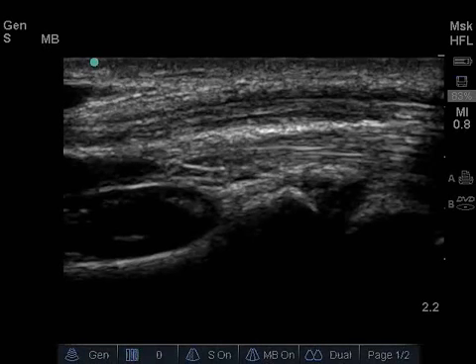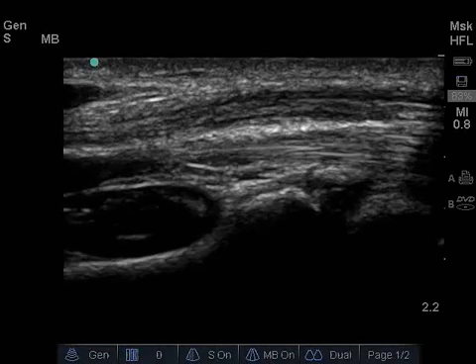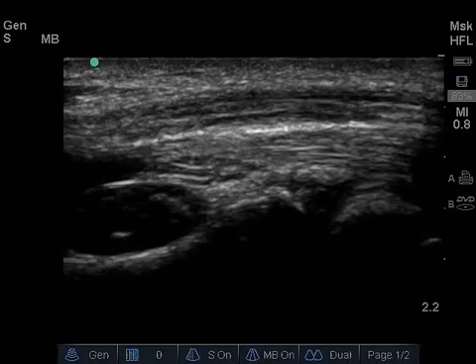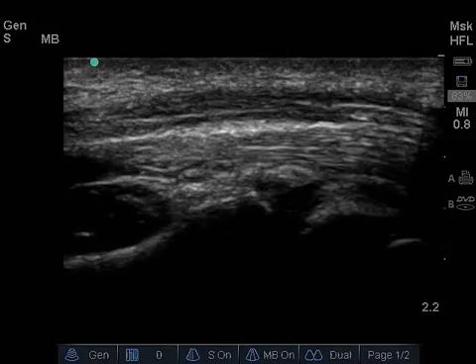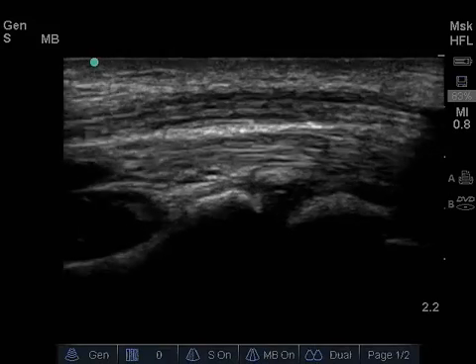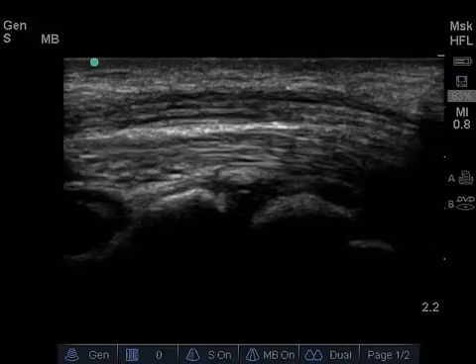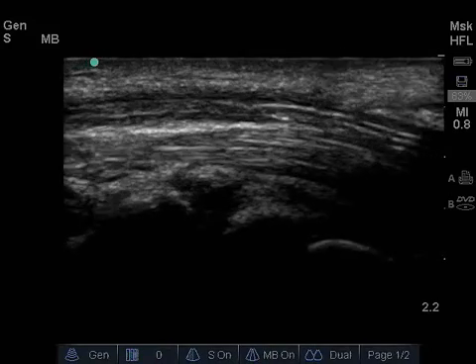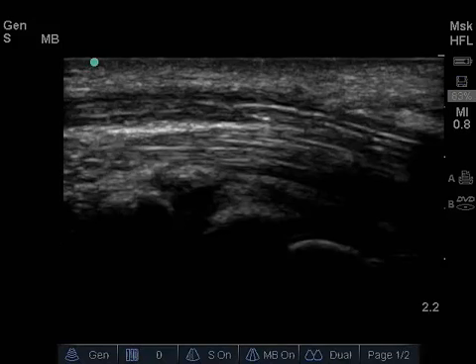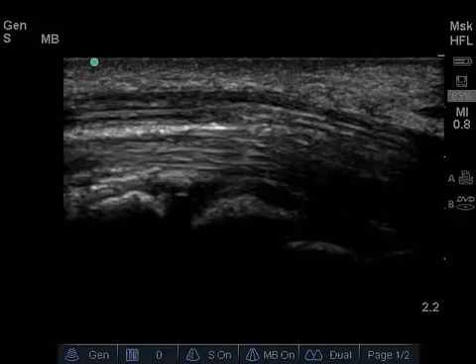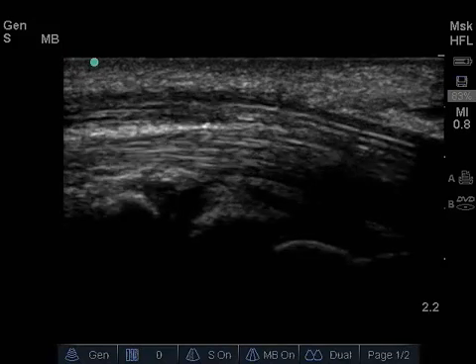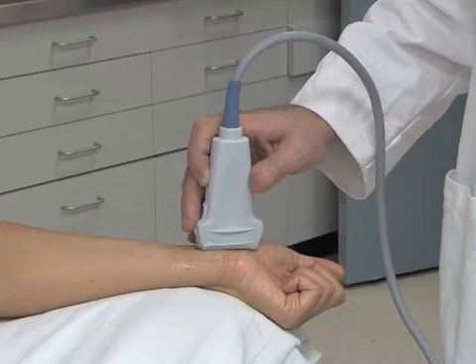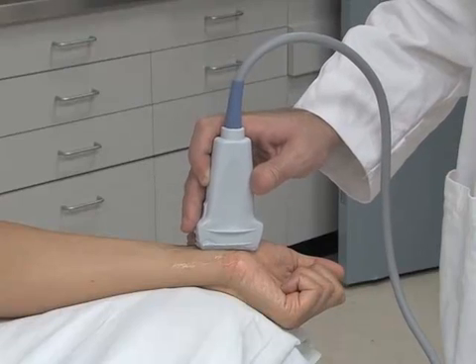A 35-year-old woman with a history of non-insulin-dependent diabetes presents with a complaint of tingling and burning pain over the first three digits of her right hand. Her symptoms are often worse at night or when holding a telephone with the affected hand for long periods of time. You decide to use ultrasound to evaluate for possible carpal tunnel syndrome.